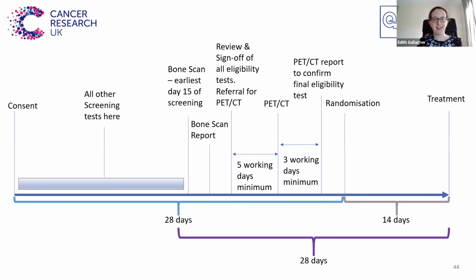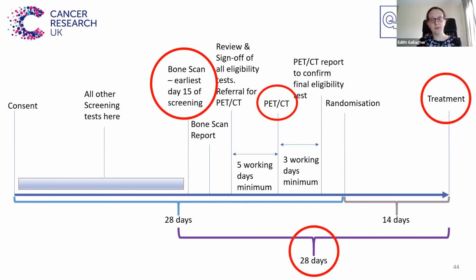This is a timeline of all those time points that I mentioned in the previous slide. You can see that the bone scan has to be as late as possible in the screening period, but still early enough that there is time for the PET-CT scan to be completed, but still within the 28-day time frame of the proposed treatment start date.